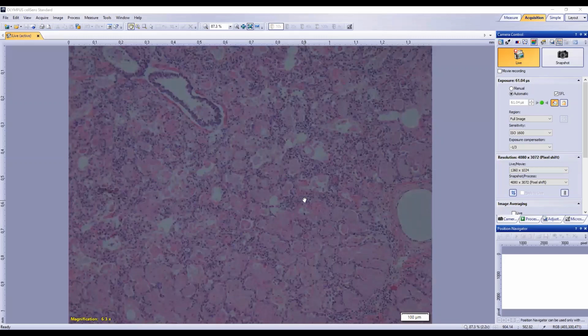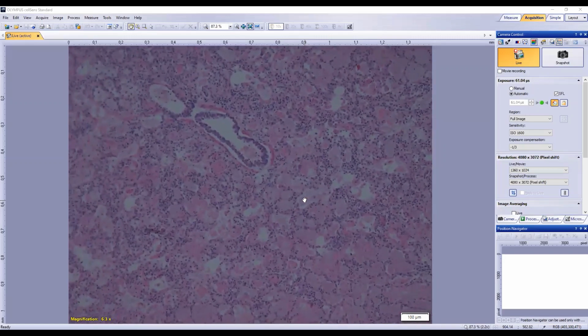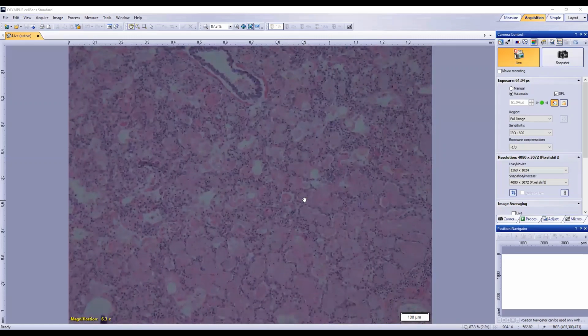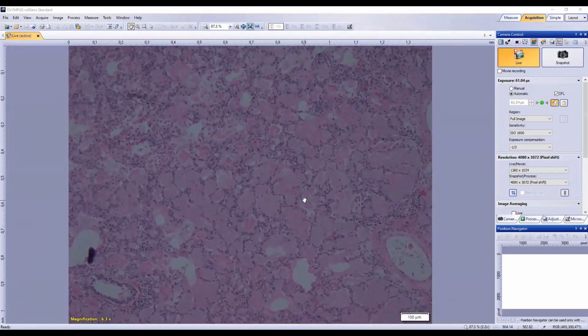because if we were looking at low power, I'm not quite sure how common pneumocystis is in horses. I've seen it in lab animal species and primates, and dogs, cats certainly. But in some of the alveoli, it kind of looks grey. Yeah, absolutely, and slightly granular. How about bacterial causes?